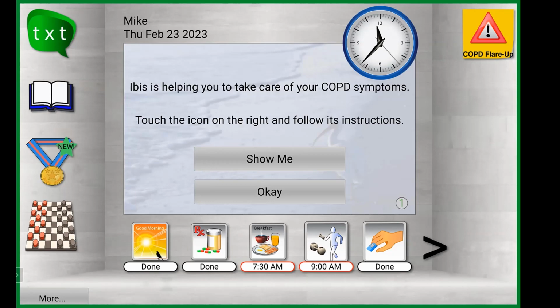And ultimately, when we get concerned because our heart starts to flutter or we get a little short of breath, it's a very anxiety-inducing experience, at least for myself personally. And that can almost compound the situation and make it even worse. And we will be there for you immediately when those things start to happen. So you don't have to worry about getting in touch with anyone. We will get in touch with you.